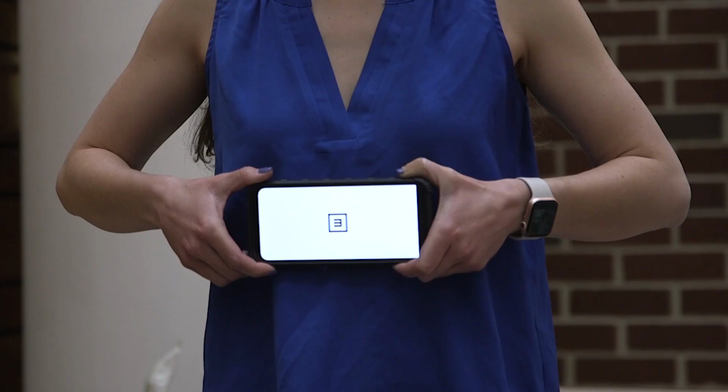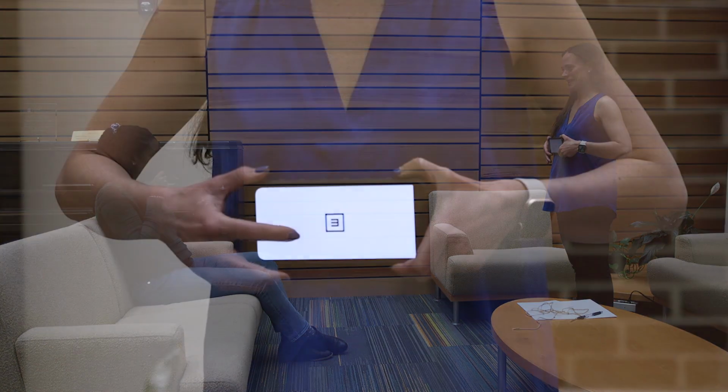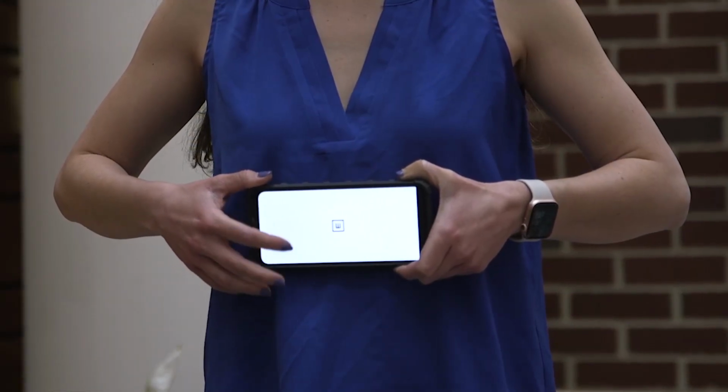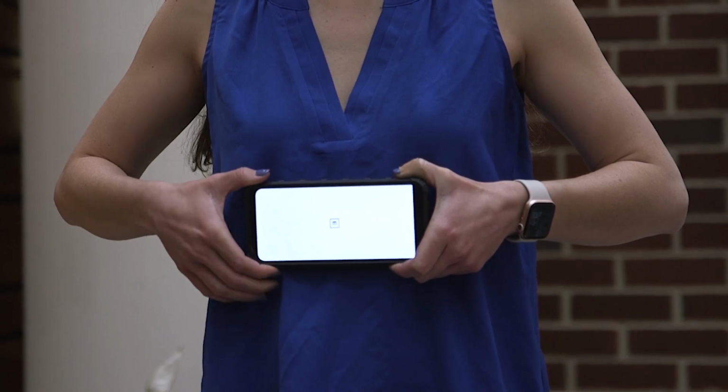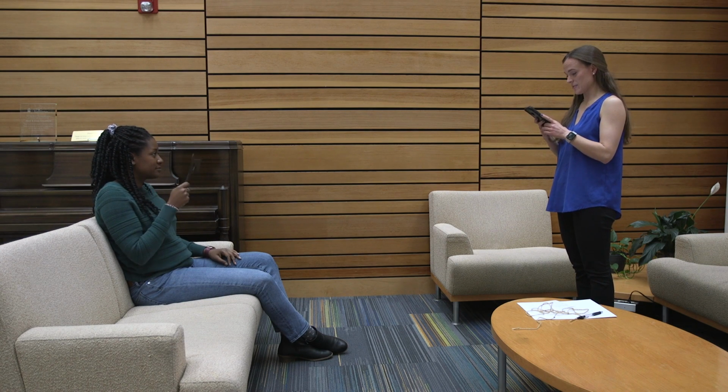The E has now switched to another direction. Ask the participant again what direction the E is facing and swipe the phone according to their response. Continue prompting the participant and swiping the phone with their response until you hear the final noise and feel the vibration from the phone. This indicates that you have completed the screening for the right eye.